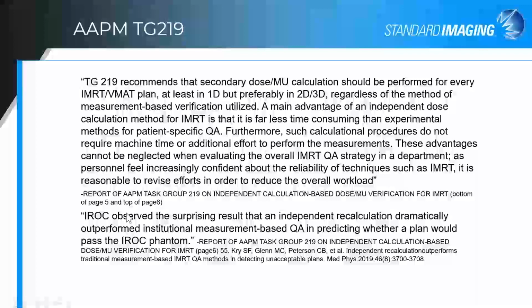The other item that follows shortly after this excerpt is a statement that IROC has observed the surprising result that an independent recalculation dramatically outperformed institutional measurement-based QA in predicting whether a plan would pass the IROC phantom.